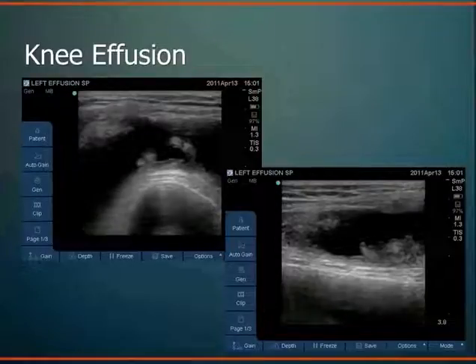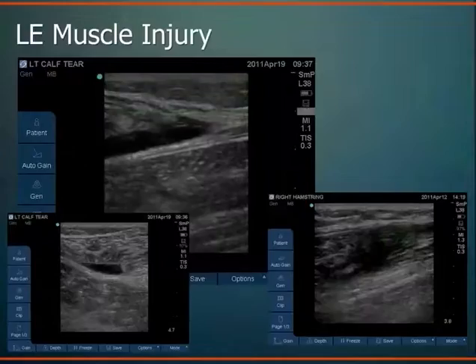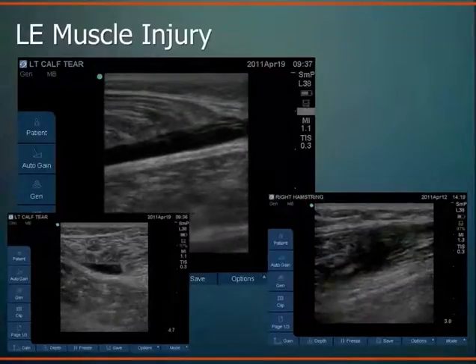So if you need to aspirate that fluid, very easily identified, okay, that's where the suprapatellar pouch is. There's the swelling. Stick the needle right there, and you're right on it. And so very easily visualized and very applicable to a clinical setting.